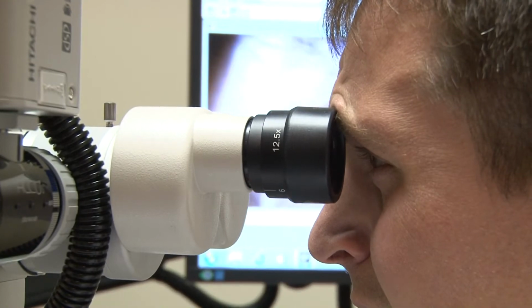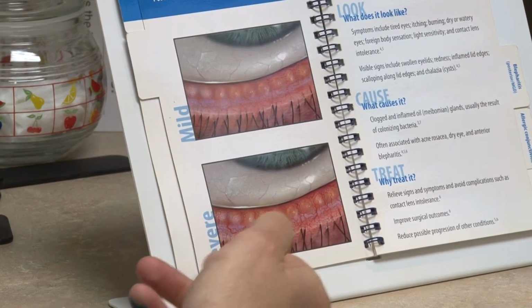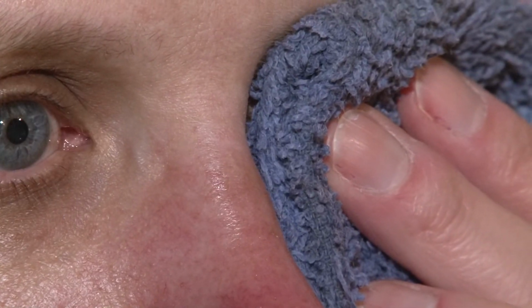and meibography. We find that this is a severely underutilized technique in correctly diagnosing, evaluating, and treating meibomian gland dysfunction and evaporative dry eye disease. All too often, practitioners will look at a patient and see a thickened erythematous lid margin with collarettes and diagnose blepharitis, and ask the patient to do a warm compress and lid scrubs twice a day.